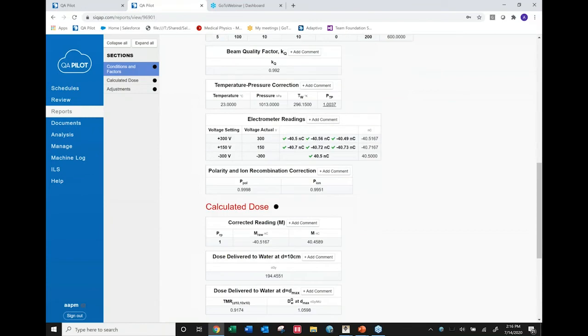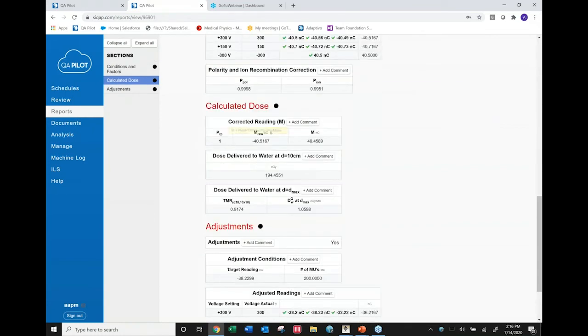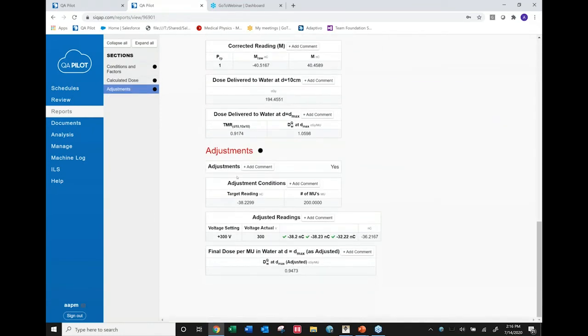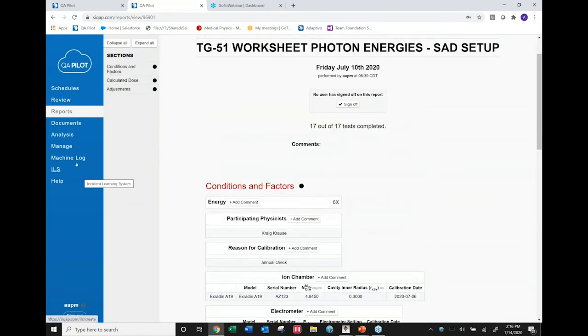It'll calculate these values here, your electrometer readings. Then you have your calculated dose, and if you had to make an adjustment at the machine and you retook your reading to make sure that you're within a tolerance that you were expecting. So, quick overview of that.